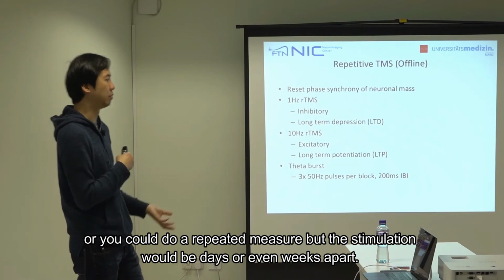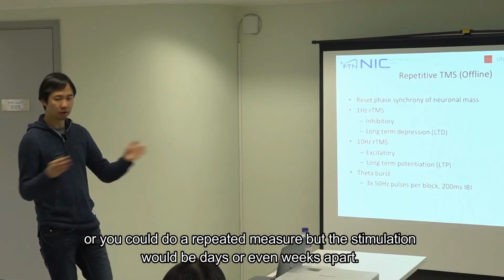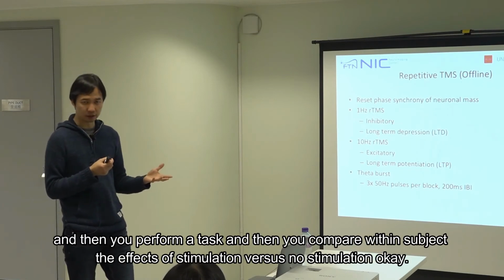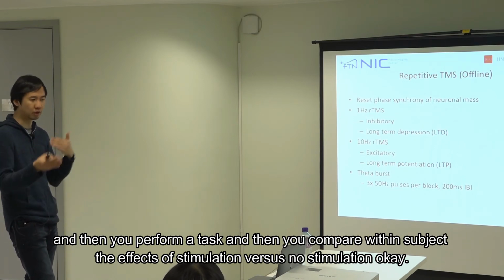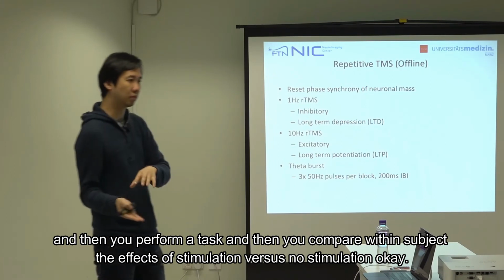Or you could do a repeated measure, but then the stimulation would be days or even weeks apart because you don't want to have any kind of carryover effect. And then you perform the task twice, and then you compare within subject the effect of stimulation versus no stimulation. Okay?